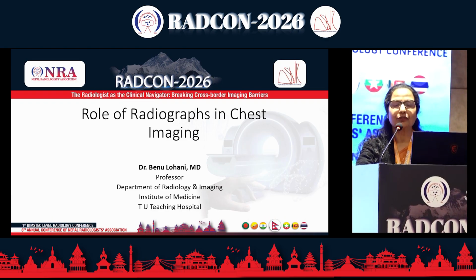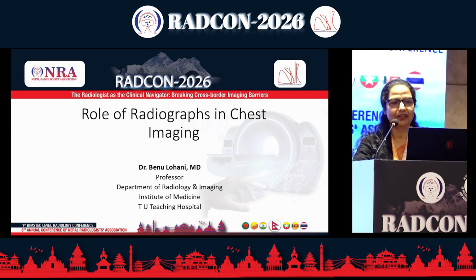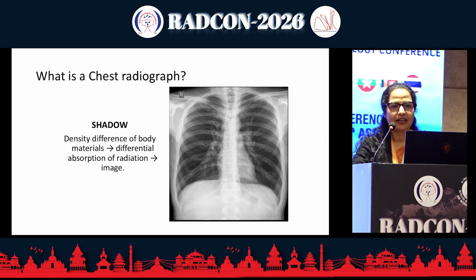Even though it looks very, very simple, sometimes interpretation of chest radiographs is the most difficult among the radiographs. So, I've tried to simplify it, and let's see how much I can cover within 15 minutes, because our body has, especially in the thoracic region, different densities of tissue.